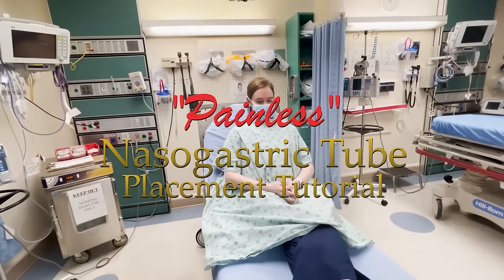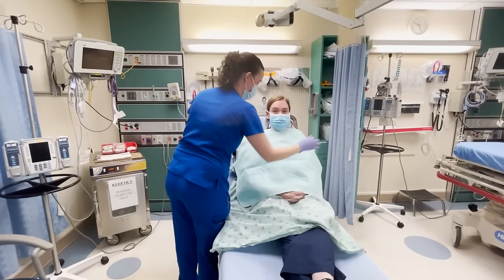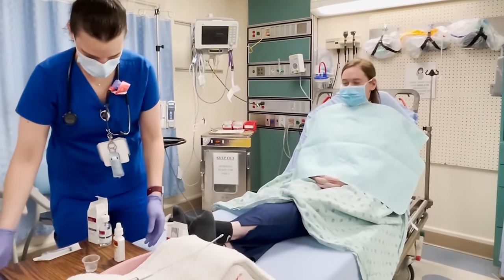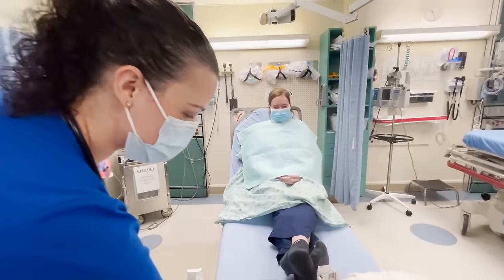What we're going to demonstrate today is how to do a painless NG tube placement. Our volunteer here is an emergency medicine resident. She's doing this entirely voluntarily — correct? No pressure, you can stop at any time.